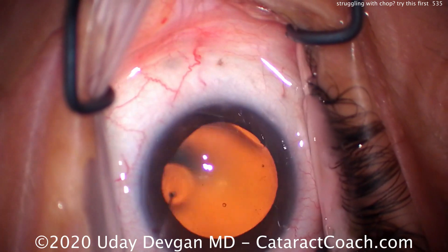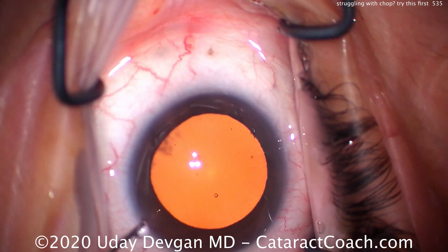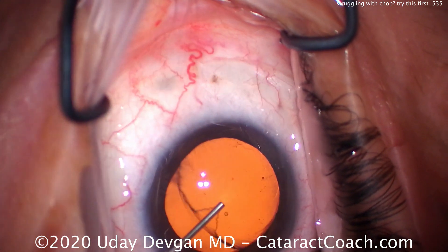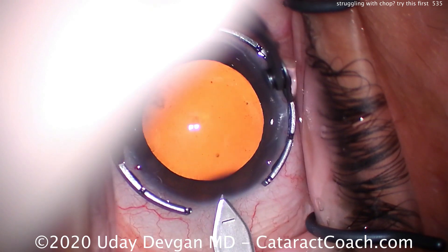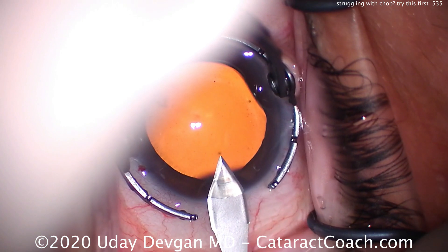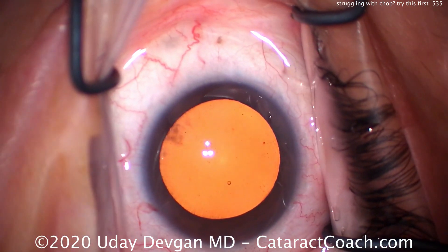With Divide and Conquer, you make your grooves and you can wait as long as you want before splitting those grooves and cracking the nucleus into pieces. But with FACOCHOP, when we're chopping in the capsular bag, we have to buzz in with the FACO probe, and within the next second or two we have to accomplish the chop. That's because we're using the FACO probe to hold the nucleus with high vacuum, and if we let that vacuum drop, we lose that holding power.